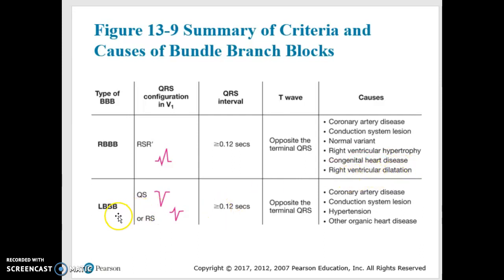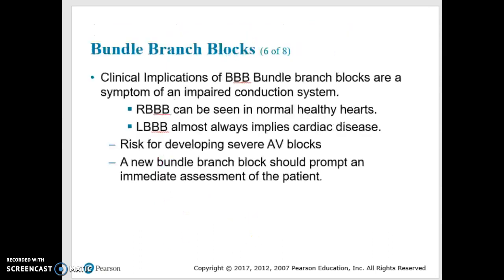A left bundle branch block, this is your QS configuration in lead V1. You have a wide QRS complex, and the cause may be coronary artery disease, conduction system lesions, hypertension, or other organic heart disease. Moving forward, let's talk about the clinical implications of a bundle branch block.